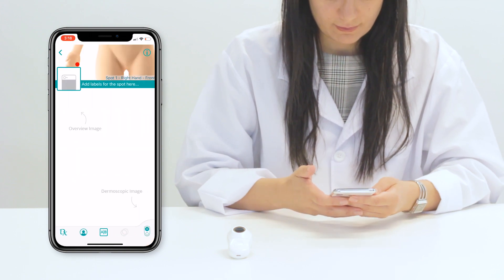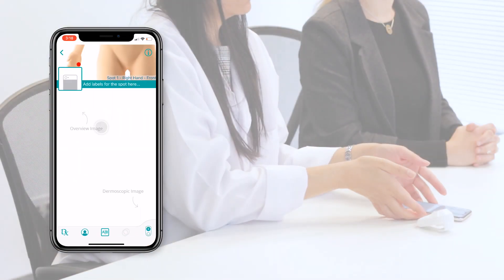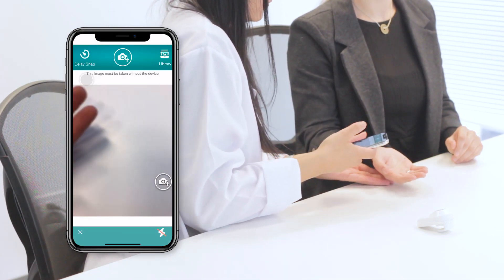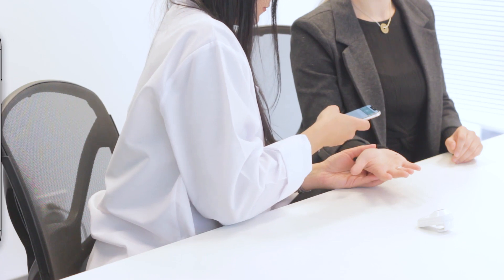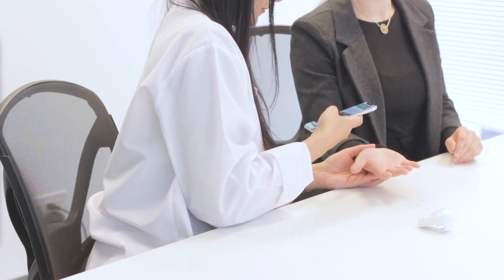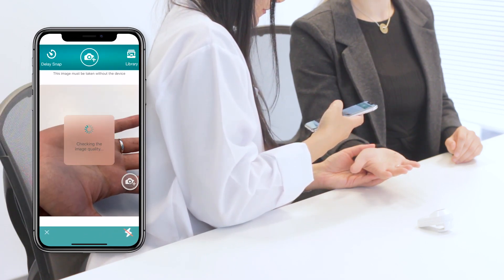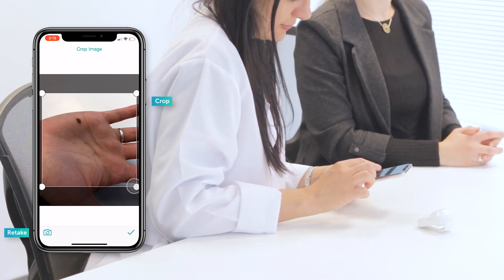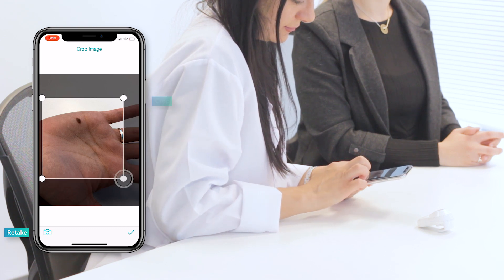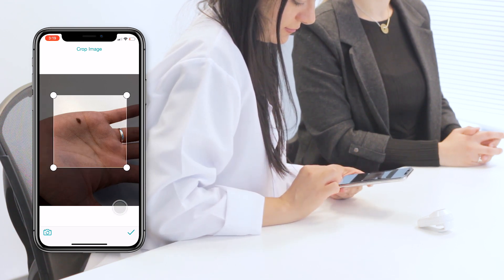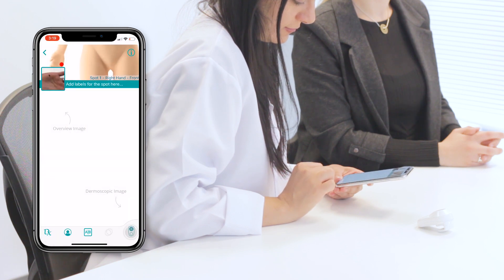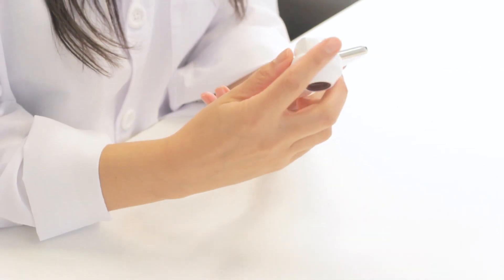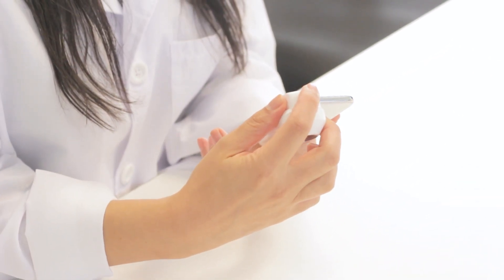Now we're ready to add images. Let's start with the overview image — press the overview icon to take the image. Focus the camera by tapping the spot. You can now crop or retake the image if necessary. Next, let's add the dermoscopic image. Attach your mobile dermascope to your smartphone.